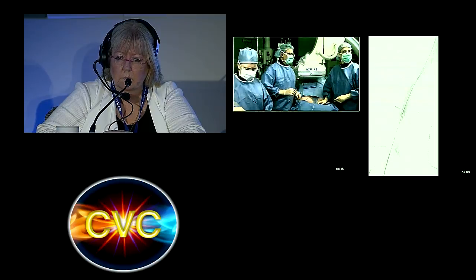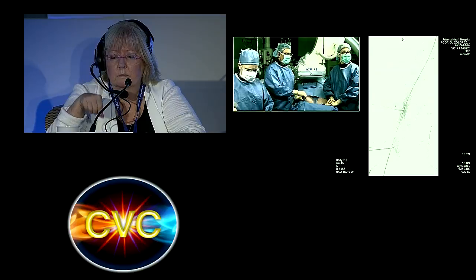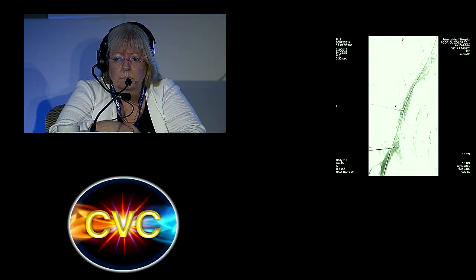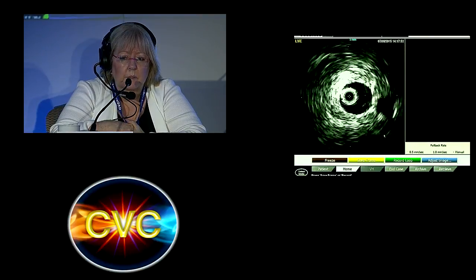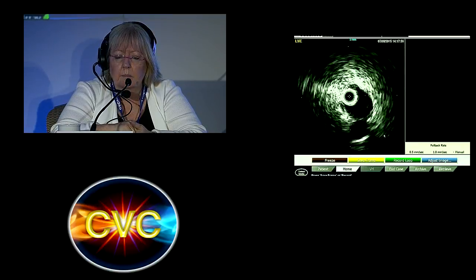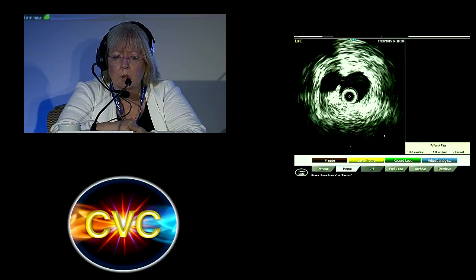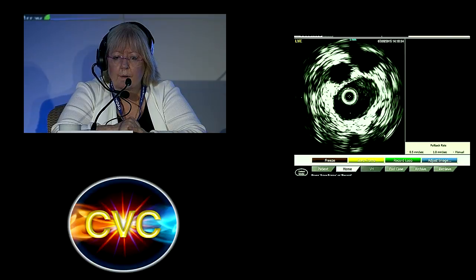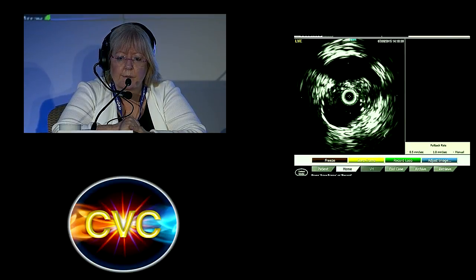Yeah, numbers of the collaterals and tributaries are diminished now. So we have pretty much direct flow through the iliac. Julio? Yes. I am wondering why the contrast doesn't clear through that mid-external iliac. It stays below that narrowing. Would you want to do another venogram? Yeah, we can do that.